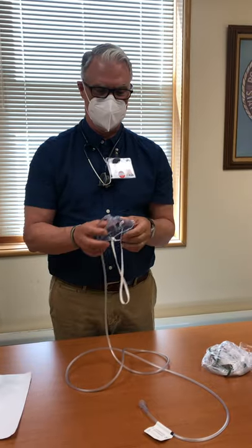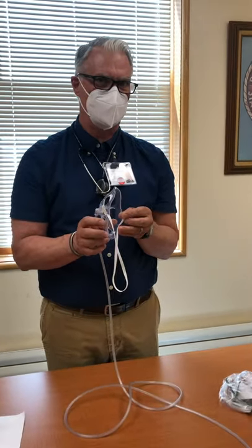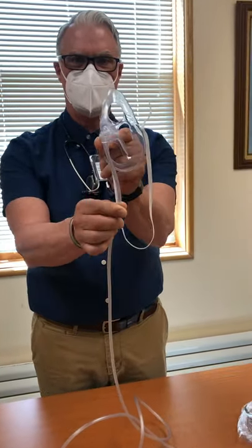Hey there, I'm Greg, the respiratory therapist here at Rockingham County. We are replacing masks that are on your crash carts and we want you to be familiar with the new mask that we're putting on there.